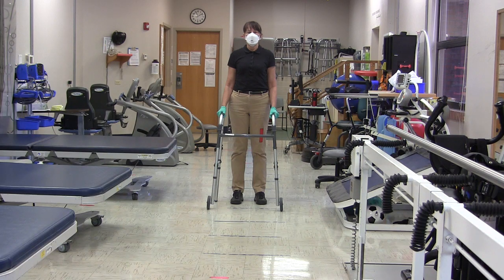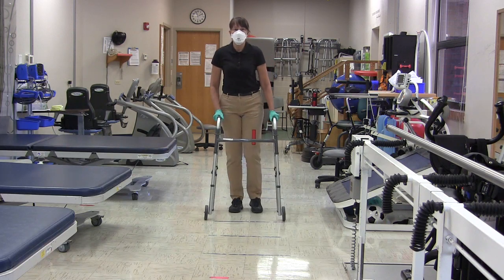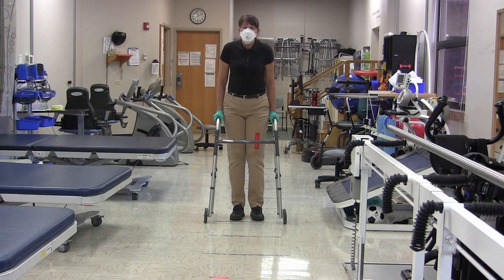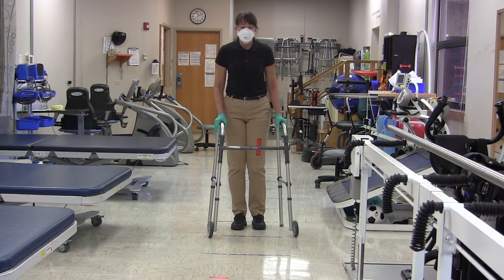Next, we are going to show you how to perform partial weight bearing on the affected leg. Partial weight bearing means the patient takes 50% of their body weight on the affected leg — so the walker and the affected leg — and the rest of the 50% of weight goes on their arms.